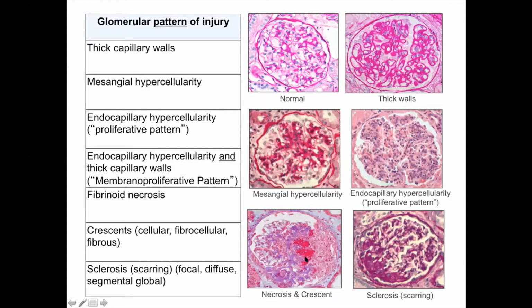Sclerosis هذه crescent when it heals, when it scars over يعني like, I don't know, a couple of weeks. It might leave us with an adhesion of this loop to the Bowman's capsule, فهذا يسبب لنا sclerosis أو scarring. Okay. طبعا ساعات إن عندنا sclerosis and scarring that is not related to crescent formation in the case of FSGS, where basically it's due to prolonged proteinuria.